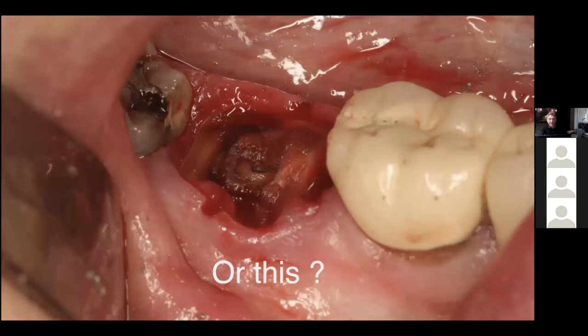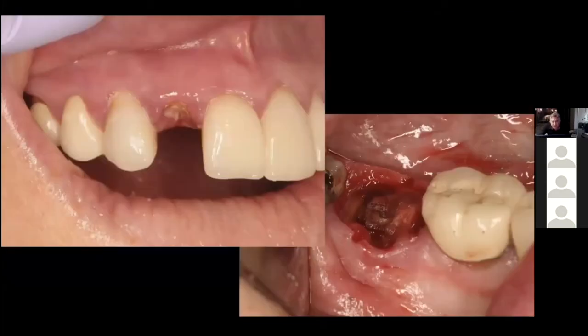And why do I say that? You're going to hear me talk a lot about you developing a strategy on every tooth you take out. And if you follow that and you take just 3 or 4 minutes to look at the x-ray, to look at the bone, this patient you're looking at is a bruxer. You almost can get that picture right now from this one little slide, where they have thick bone and long roots. And our approach, the burrs we're going to use, how we're going to get this tooth out is a bit different than the one I just showed you. So we're going to come up with strategies that we need.